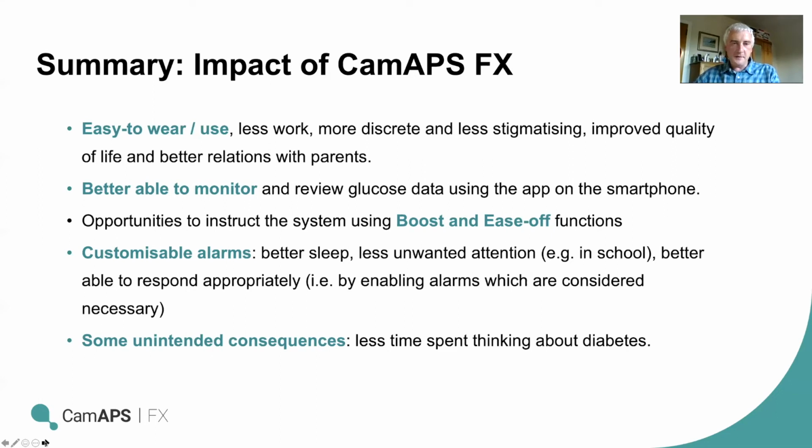Being able to customize alarms also helped limit unwanted attention from others in public settings, and it meant they were more likely to respond to alarms they'd chosen to keep. But because the system was so effective, a few individuals neglected or simply sometimes forgot to perform key diabetes tasks. Thank you.